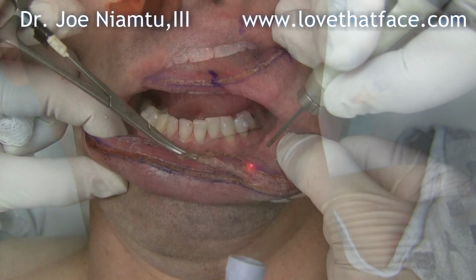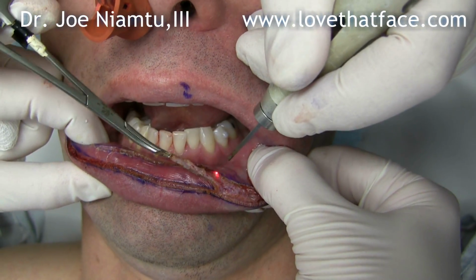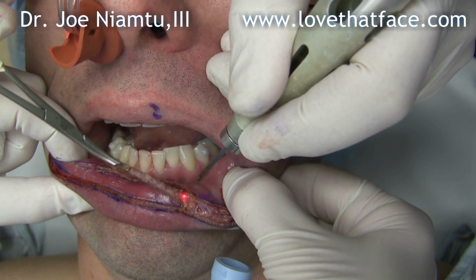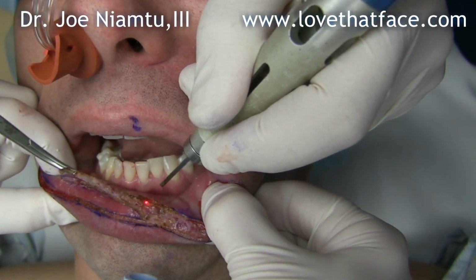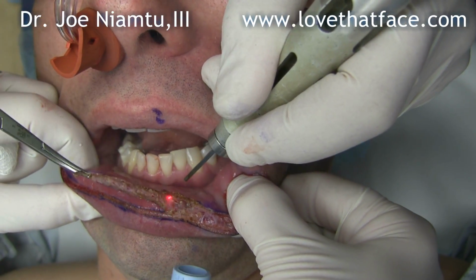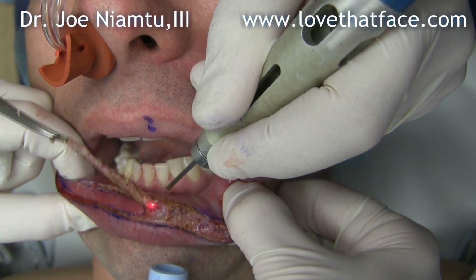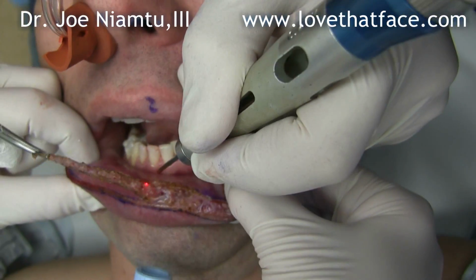Just like blepharoplasty surgery, we've made the incision. You can see it's all bloodless, and now we're going to be removing some of the extra mucosa, and depending how much reduction you need, we'll sometimes take some of the deeper tissue, the muscle, and even the salivary glands or the other structures of the lip.